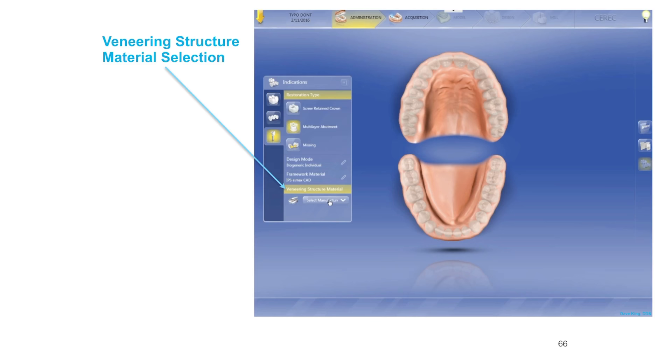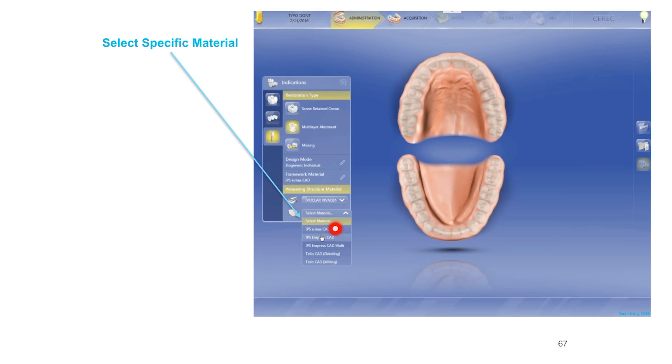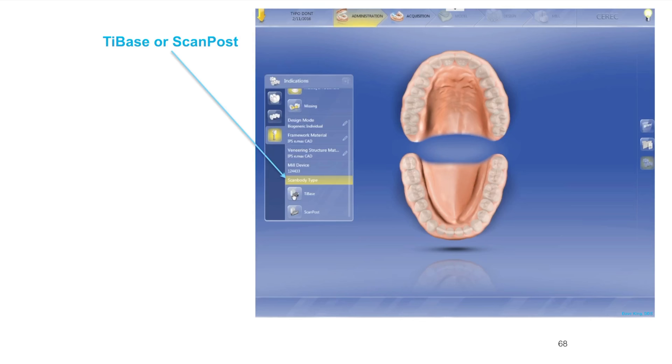Once we've got the framework material selected, which in my case is always Emax, I don't have zirconia set up in my office yet. The veneering structure is really up to you. You can make an Emax abutment and then make a Vita crown or an Empress crown or an Empress multi crown or a Vita Enamic crown. This is entirely up to you, what your preference is.